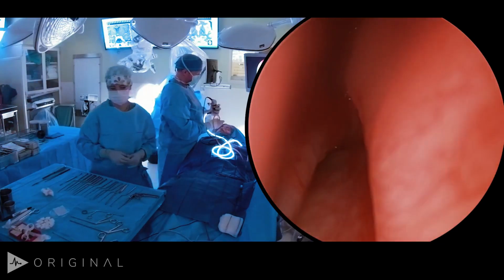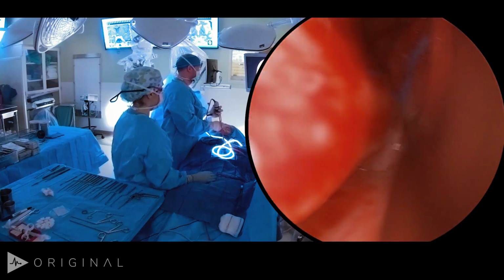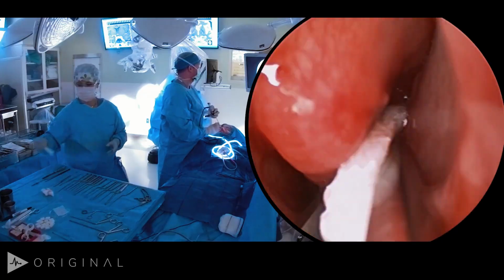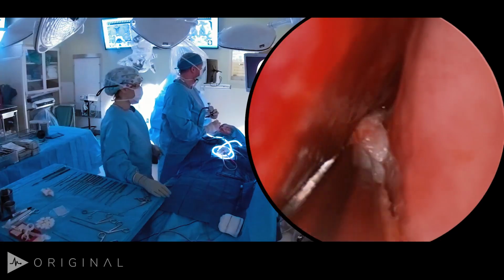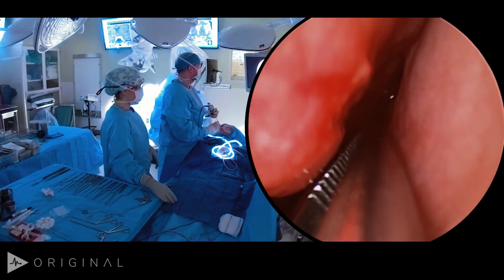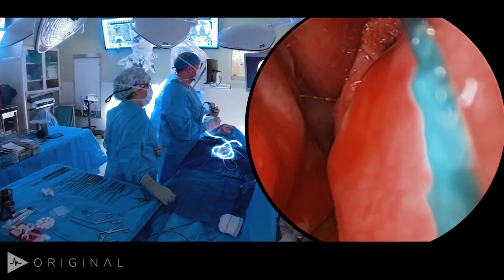It's important to suction out your nasopharynx intermittently, because that kind of serves as your reservoir for drainage of blood. That way it doesn't just keep pooling up in the nose. You obviously want to be careful when you're putting your instruments in and out of the nose. You want to cause as little mucosal trauma as possible, because the more blood that you have, the harder it is to see, and also the darker your screen gets, the blood will kind of absorb a lot of the light.